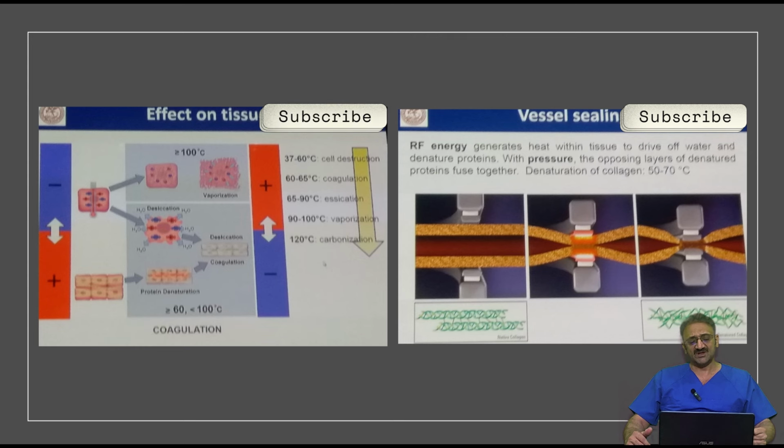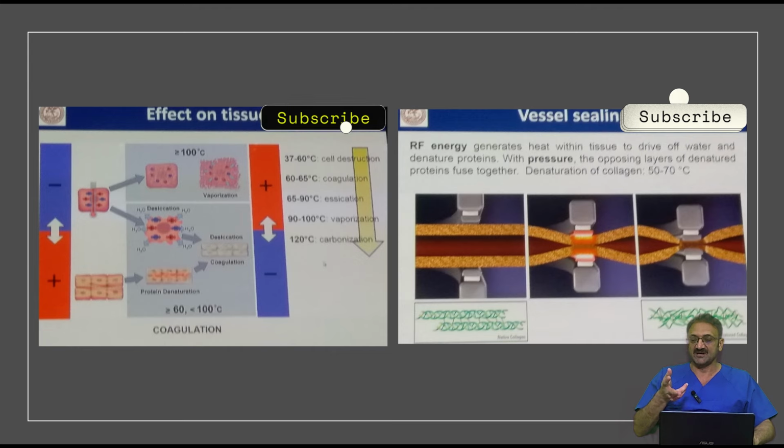However, the effect of diathermy, whether monopolar or bipolar, depends upon the type of tissue, and the amplitude which you have preset in the console, whether you have a preset of 30, 35, 50, 60 or more. It also depends on the time of the application, for how long you are applying it.